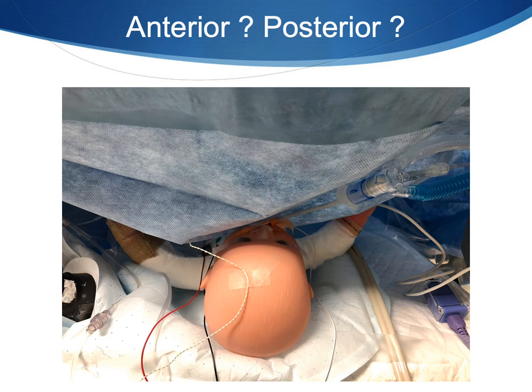Okay, here's a picture of why it's so important. This picture represents an infant baby. Now, can you tell which direction the endotracheal tube is positioned? I know I can't. Now, mind you, if you do preemies or micropreemies, you won't even see this much of the head because that drape is going to be even more on it because the body is so small that it all becomes part of the surgical site. Now, when you're dealing with this small pediatric population, they're lying on top of a bear hugger, which is blowing warm air up at them to the posterior side.